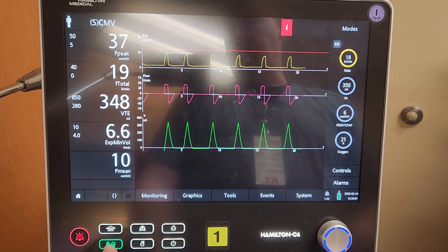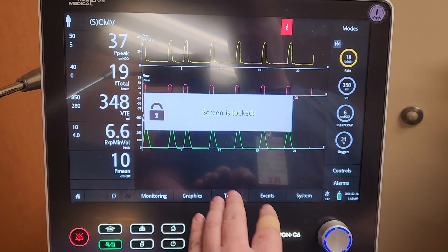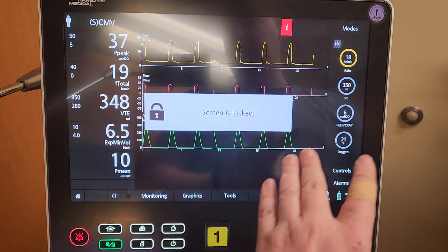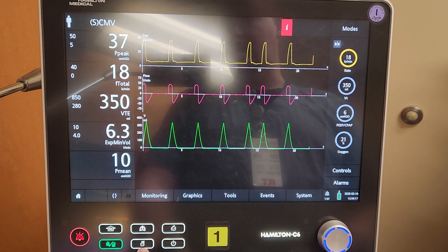Here is a screen lock button — this is kind of my favorite button, because if I accidentally press this screen, and it is a very sensitive screen, it will just beep and tell me the screen is locked instead of accidentally touching a setting and making changes I didn't want to do.